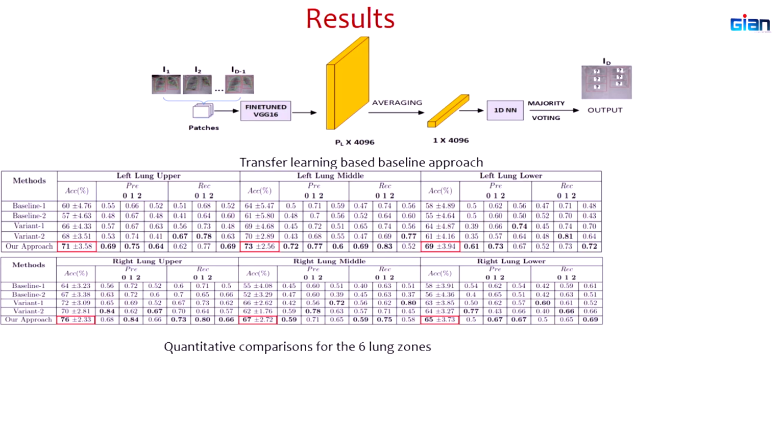Nowadays, you have much better and more powerful models. These models are used as feature extractors. You extract features using the different models, and then you provide those features to, let's say, a simple classifier, and you train the model. Or you can start with pre-trained weights, take your limited data set and keep fine tuning it a little bit further and see how well the results are.